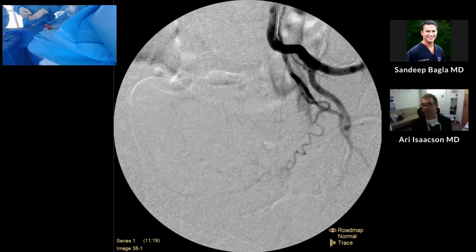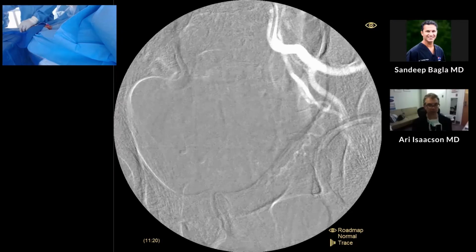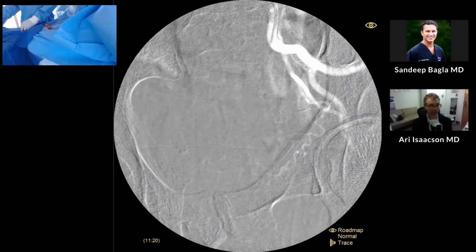And in your opinion, what did you think in terms of the previous catheters? How often would you say that length of the catheter was an issue? That's a good question. I think we first started doing radial PAE maybe 4 or 5 years ago. Over the years, I've gotten more conservative with how tall I'll go. The reason being, it's one thing just to get your microcatheter to the mid-prostatic artery, but a lot of times you need to advance it further to be able to coil embolize anastomoses, or maybe interrogate a distal pudendal branch or distal obturator branch. And so I found that my height limit has come down further.